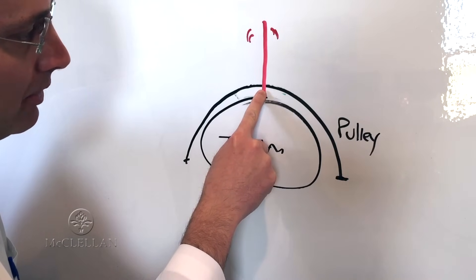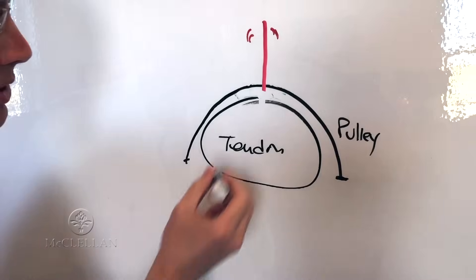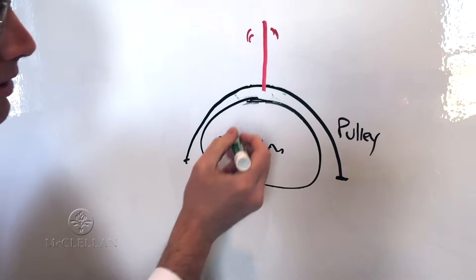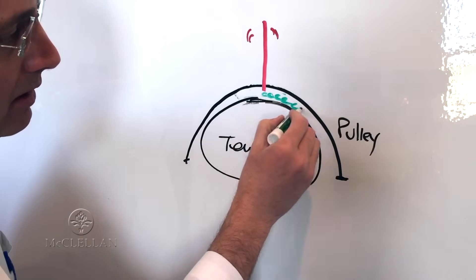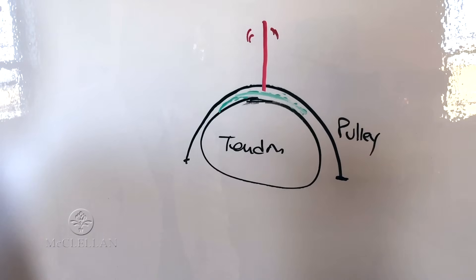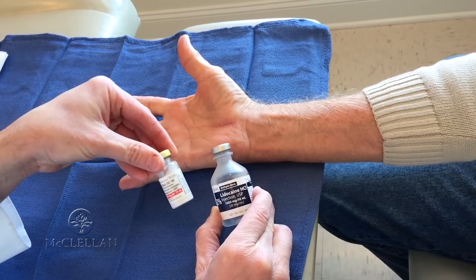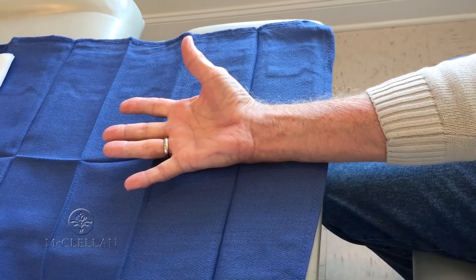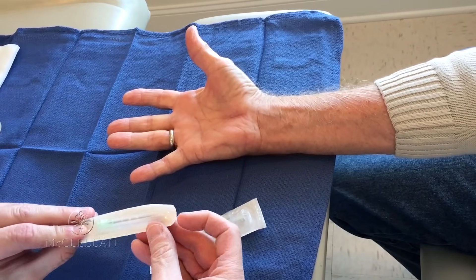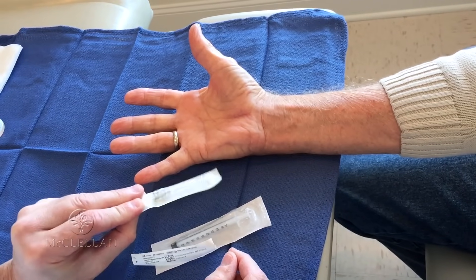So then what you do is you simply back up a little bit until the needle stops moving with the tendon, and then you gently press down on the plunger and you can get the steroid and local anesthetic right into that space, which is where you want to be. I like a 1cc syringe, lidocaine and Kenalog — a larger needle to draw it up and then like a 27-gauge to inject it.